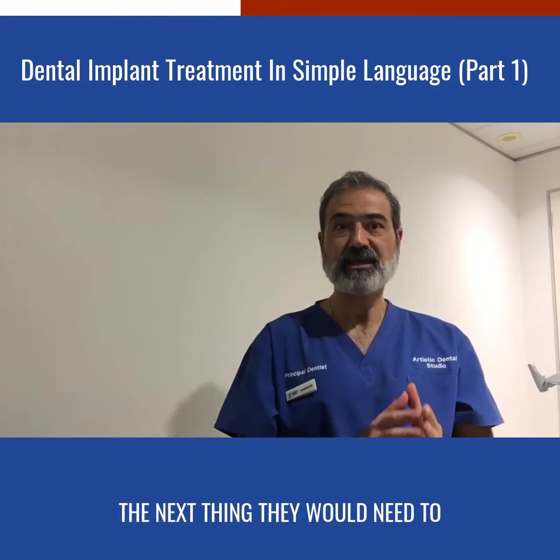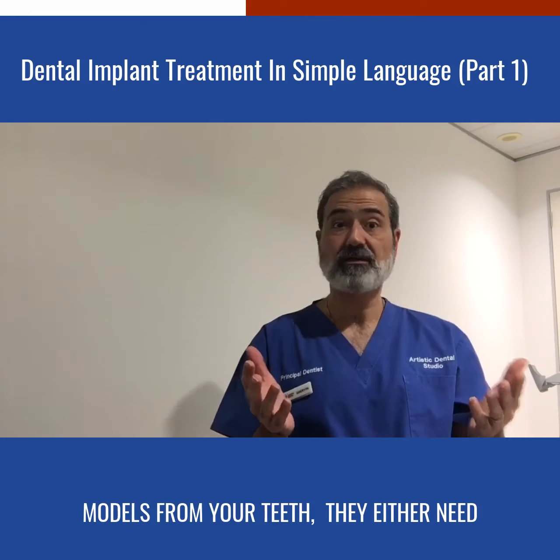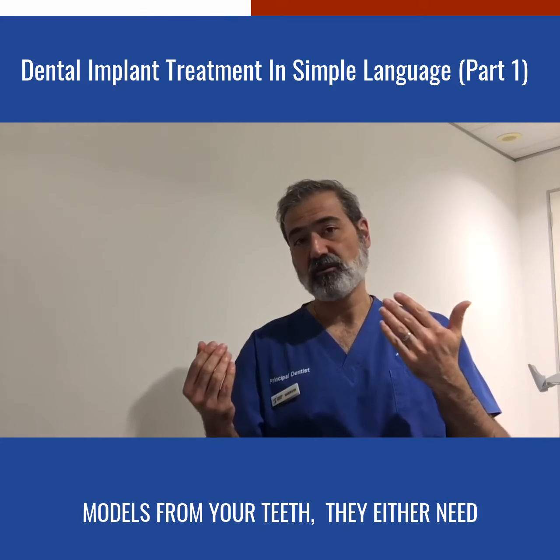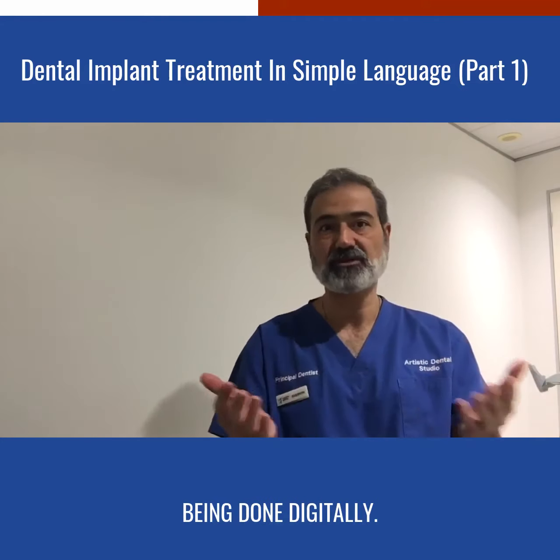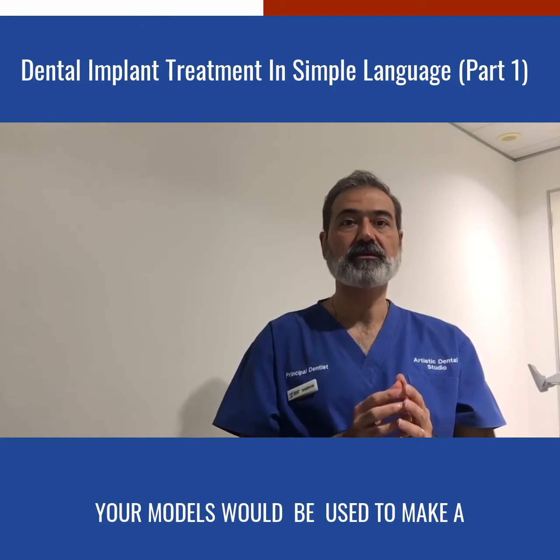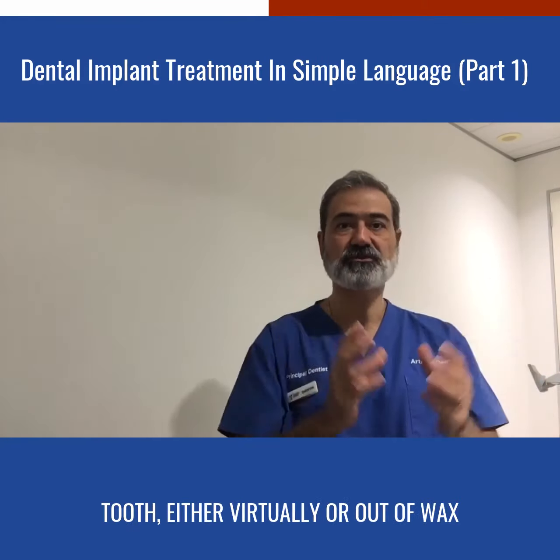The next thing they would need actually are some models from your teeth. They would either need to take some impressions or take some intraoral scans if everything is being done digitally. Your models will be used to make a prototype of your future tooth, either virtually or out of wax to show you on second session.